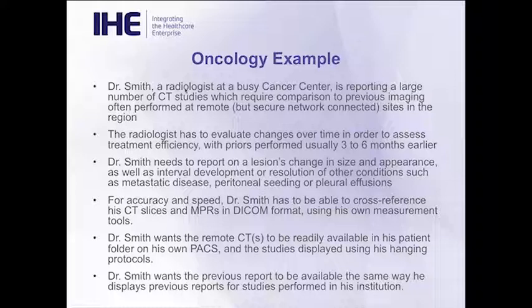So we just took the oncology example, but I can tell you it's even more critical sometimes in the emergency setting where you don't have a previous CD, you don't have any other way to see the previous study to compare with the current. So that's why we identified the need for IDEP as a priority, and I'm very happy that this profile has been approved.